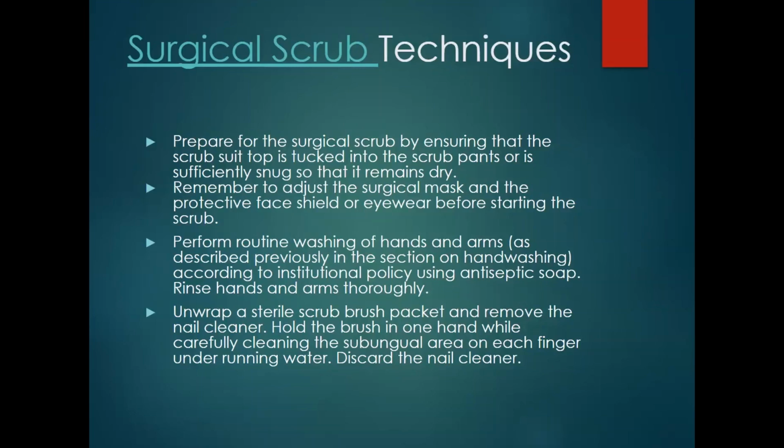So remember I talked earlier about keeping your hands at waist level? It starts from this point. So when you're discarding that nail pick, you really just reach out, keep your hands above waist level, and just drop the nail pick, which is a little something that we have to get used to because you always just kind of want to toss it and bring your hand close to the trash can. So that's no longer done. You just reach out and let it fall into the trash can.